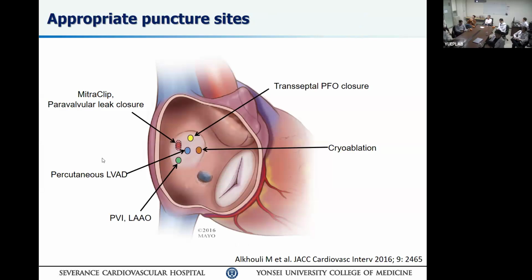So with the posterior puncture, it will be easy for you to contact the left pulmonary veins. But in order to contact the right pulmonary veins, the second puncture should be a little bit anterior, so that anterior puncture and clockwise torque will enable you to contact the right inferior pulmonary vein.